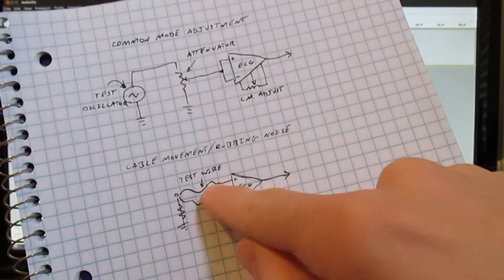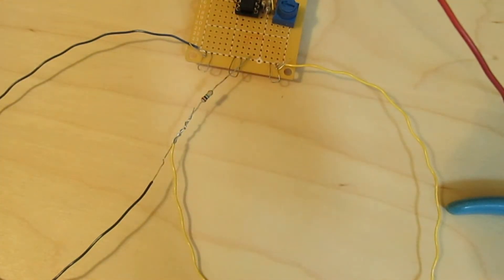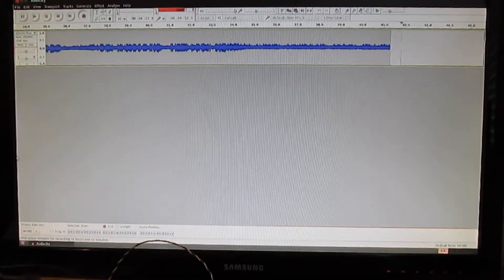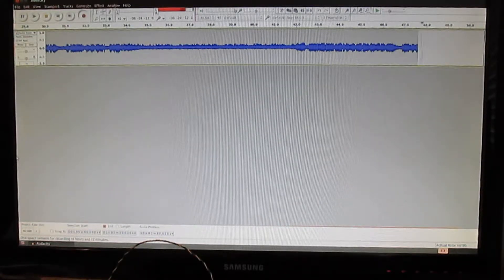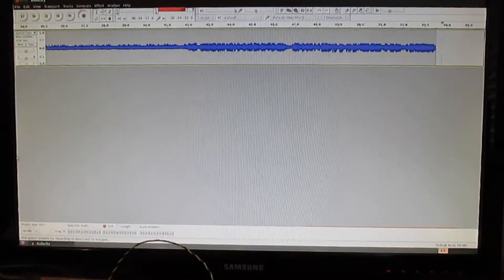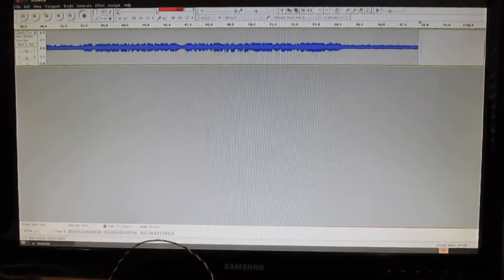So now I've added a second test wire, so they should both be picking up the same amount of 60 Hz, and that should show up as common mode to the input and should get rejected. It looks like it's picking up a bit more noise, and it picks up even more when I just touch either of the wires — just touching the insulation will do it. But it looks like it doesn't have anything to do with rubbing the insulation, and it sort of looks like that might be audio from radio that I'm picking up.